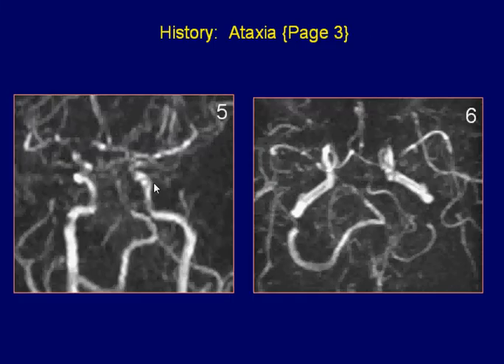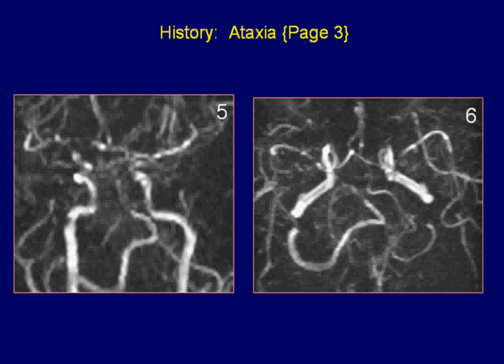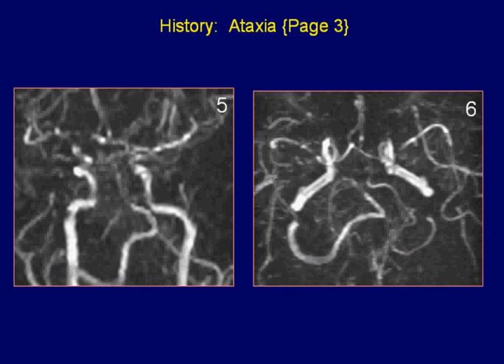MR-angiogram of the brain MIP images reveal a poorly delineated distal basilar artery. Both vertebral arteries and the proximal basilar artery demonstrate normal flow signal. Compatible with basilar artery stenosis causing superior cerebellar artery infarct.